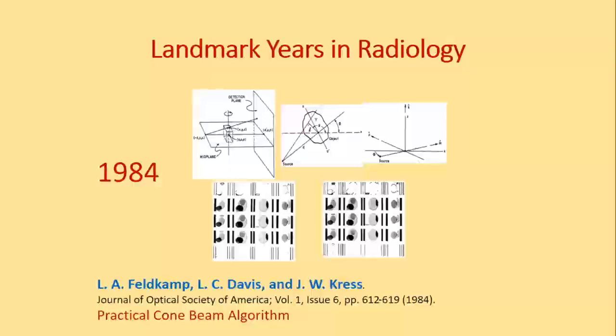And why Ford? So essentially these guys were actually mechanics working in the Ford company in America. They wanted a way to look at core porosities and fractures within nuts and bolts. So they wanted a non-destructive method to look at these. And then they began talking about this back projection and then came out the practical cone beam algorithm. So that's the fundamentals that we should know.